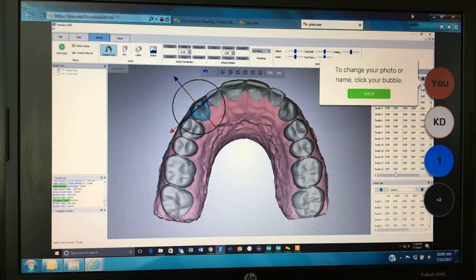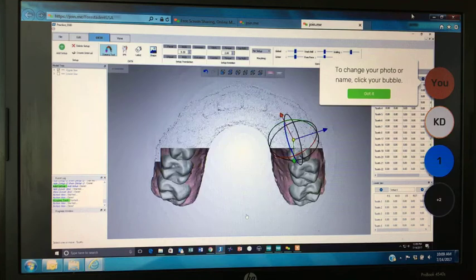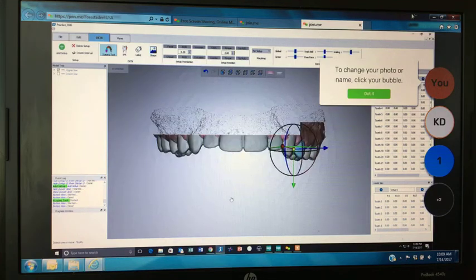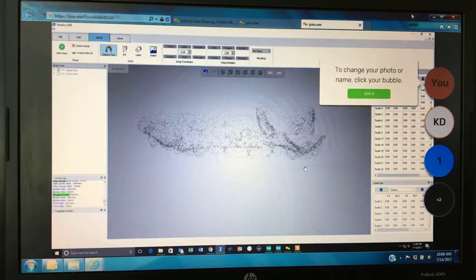Just get some other movement here. I want to check different points of view. If the gyroscope is distracting you, you can double click and it will make that gyroscope disappear so you can look at the arch more clearly. Okay, so I want to extrude. Let's go ahead and get some extrusion here just so we get some of those numbers. Okay. Alright, so I think that's pretty good with the movement.